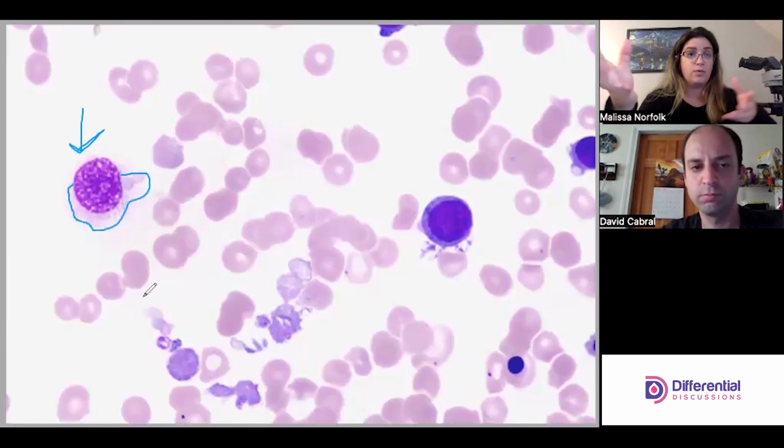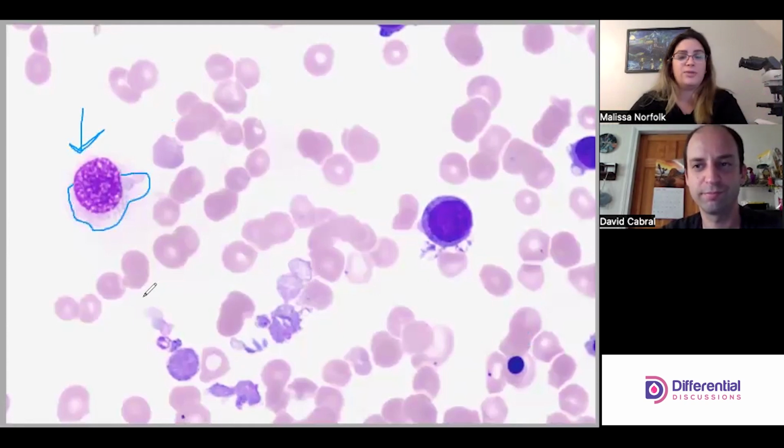And then if it was a myelofibrosis that transitioned to an AML, then you have lots of fibrotic material in there putting stress on the marrow, putting stress on developing hematopoietic cells, or it's coming from the spleen or the liver, which are not ideal environments for this. So it's easy to see why you would have these micromegakaryocyte fragments in either of these cases.